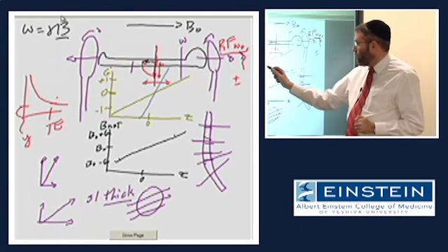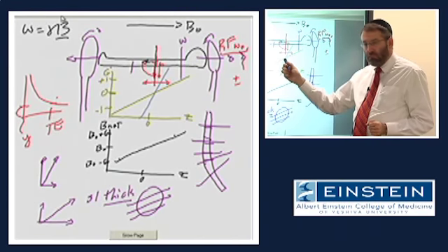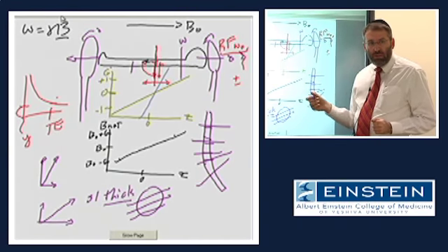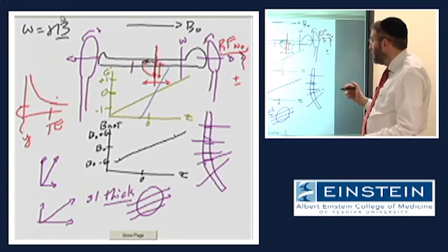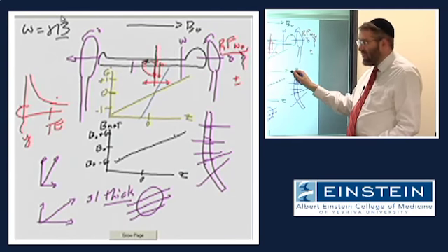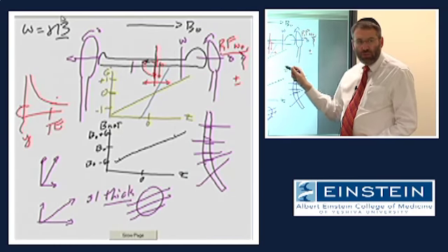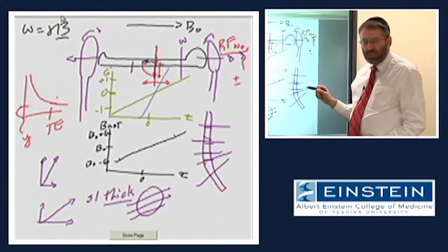So we can go from green to purple here simply by dumping more current into those gradient magnetic fields. Simply by making them stronger at each end, we will have a more rapid change in gradient magnetic field strength as we go from head to toe. Well, what happens in that case?